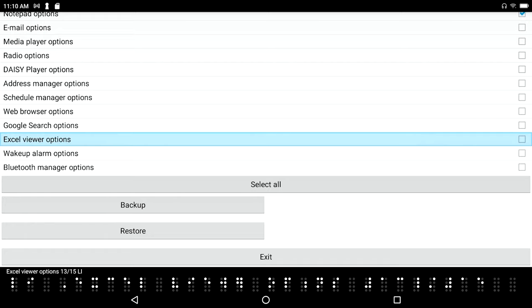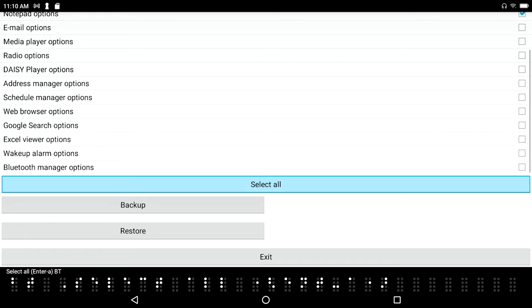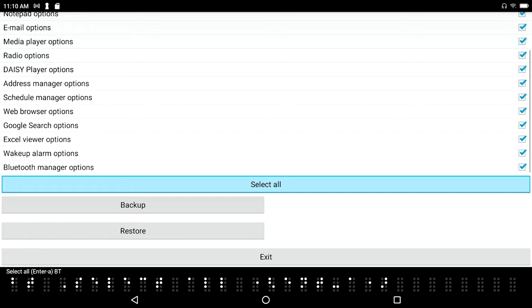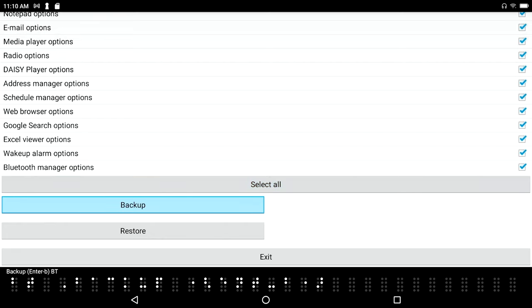But if I tab over, F3 select all enter a button, I can simply select all. Select all, select all, enter a button, I've done that. And if I tab again, backup enter B, so I've selected all those things and let's say I want to backup.